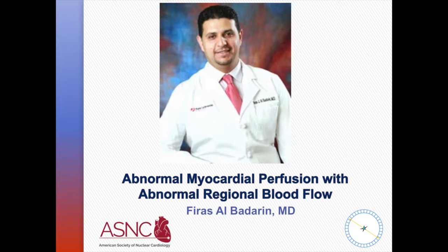There's a marked difference in radiation exposure between PET and SPECT. Obviously, there are other SPECT modalities that may lower her radiation exposure, such as solid-state detector cameras, but still might not be able to bring it down to the range that we can achieve with PET.